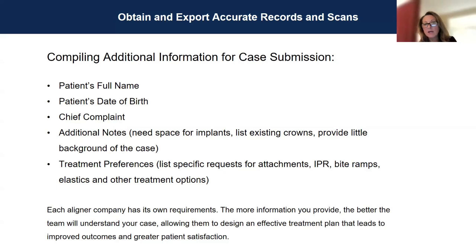And you would have to check with whatever aligner company you're working with what the extra fee is. Because let's say they're on aligner number 7 of 20, you still have 7 from 20, and all those will not fit with the case that you scanned for before the restorative. So I guess I'll just put it that way.